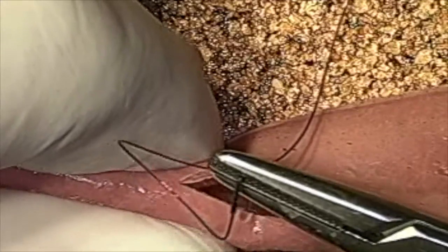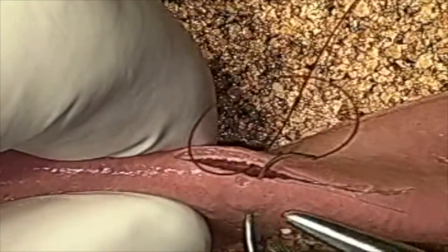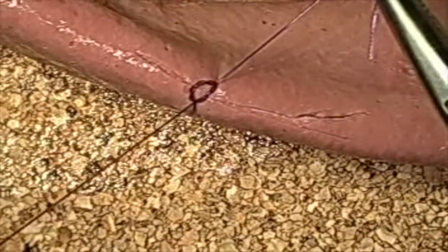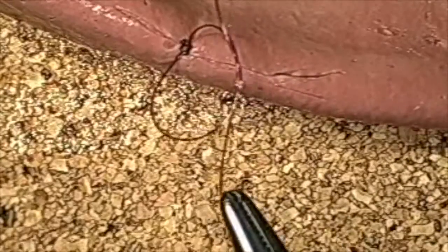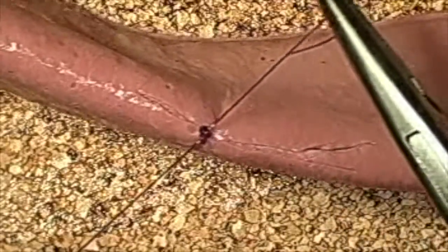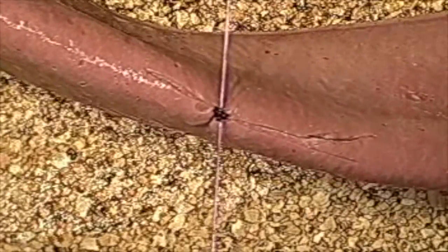What you want to do is go to the other side and do a similar thing. I am using my fingers to hold the bowel. Obviously, the bowel will also have a set of Doyen forceps or someone else's fingers. We're using a monofilament absorbable suture. This is usually typically PDS. In large dogs, you can go with 3-0, and in small dogs or cats, you can certainly use 4-0. As you can see here, we started with a surgeon's knot, and then we're also following up with good square knots, anywhere from four to six throws.